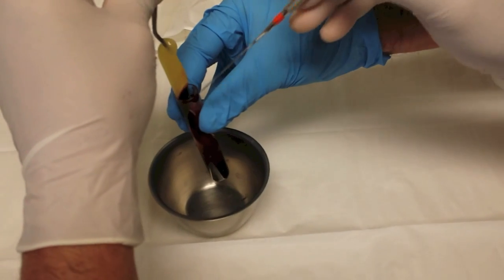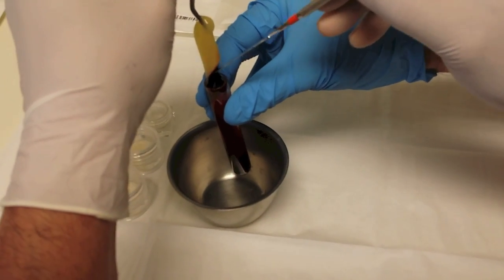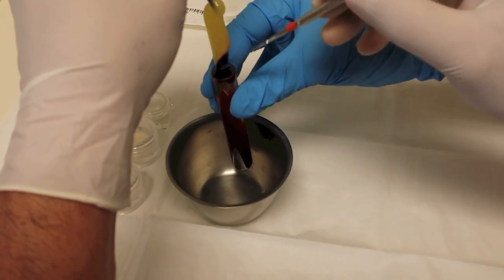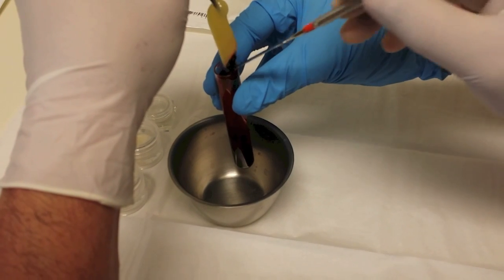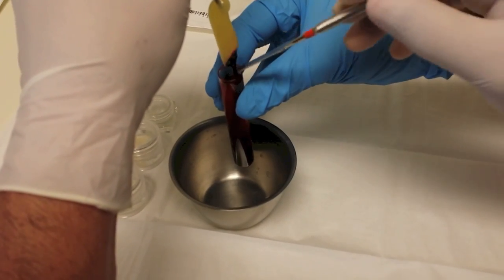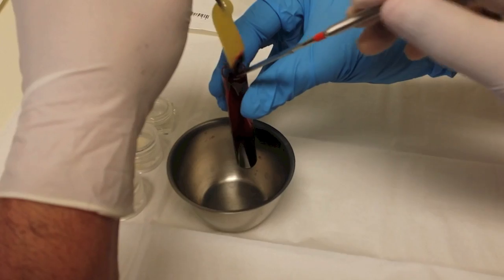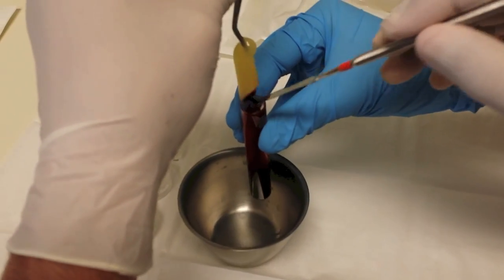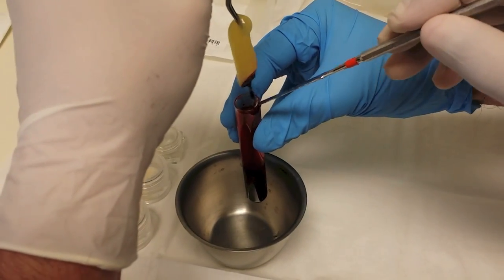So grab this and then now simply grab your other instrument and remove the red part, because the red part's already spun down. Go ahead and take it.